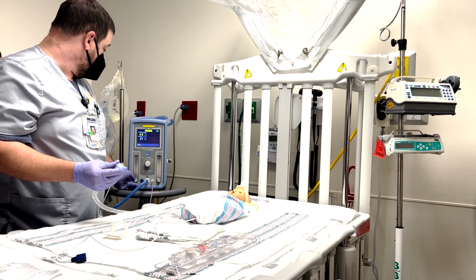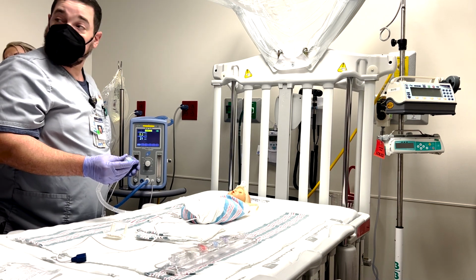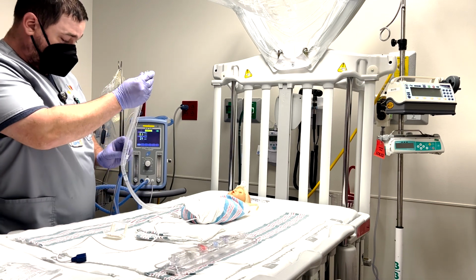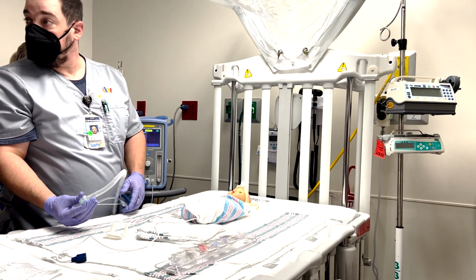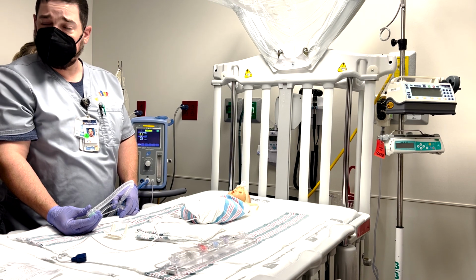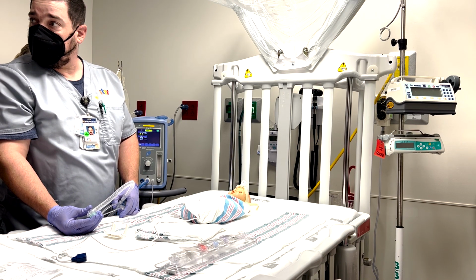The PEEP is the number that we're worried about, right? So when you talk to me or the residents, whether it's a PEEP of 5 or 6, that's the number. Anybody that's on CPAP is automatically on higher pressure than anybody maxed out on high flow. So even if we're at a PEEP of 5, think of it as the next step up from high flow.